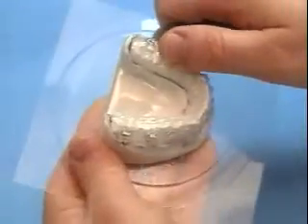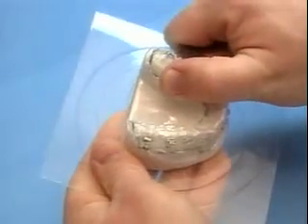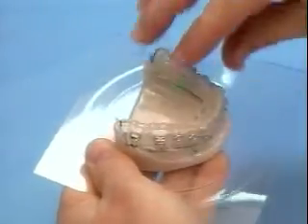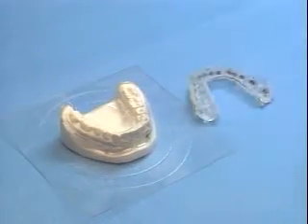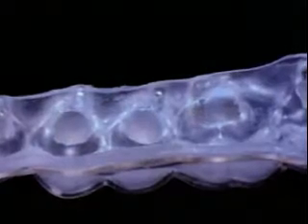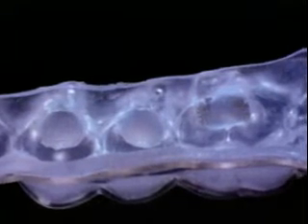You can easily separate the setup trays from the model using a laboratory knife. You have now created a setup tray with brackets positioned where you want them. Note the cured adhesive on each bracket has formed a tooth-specific custom resin base.